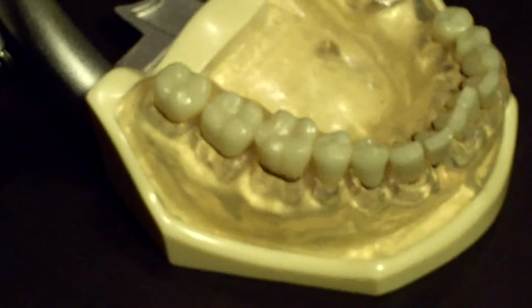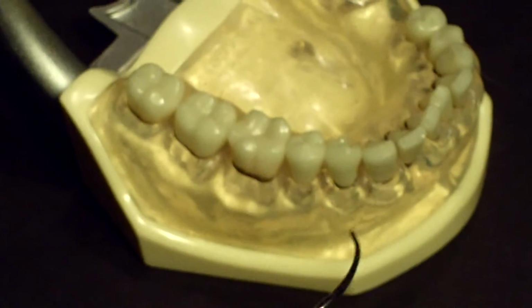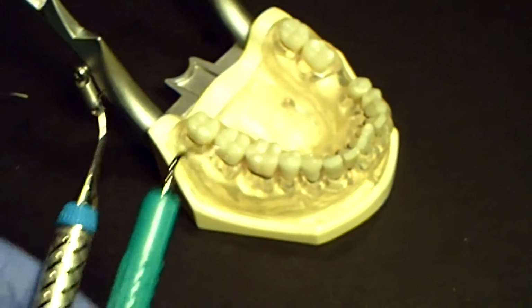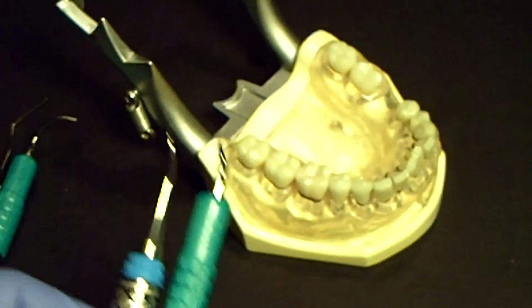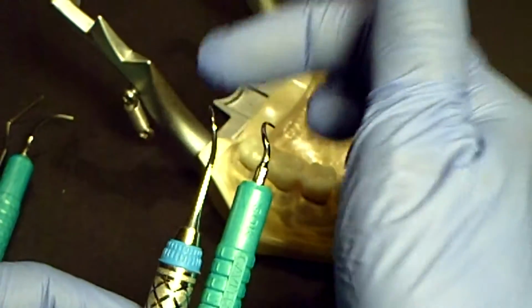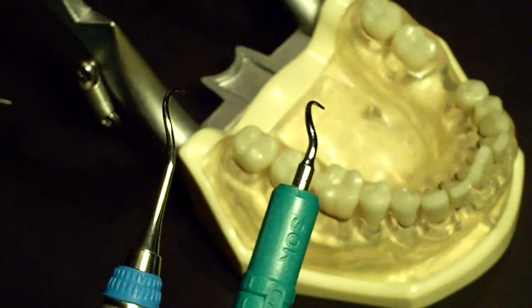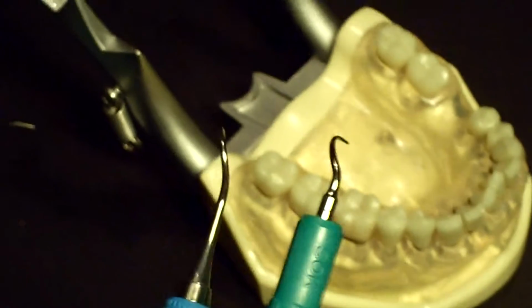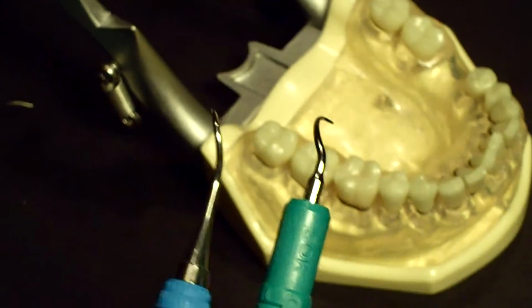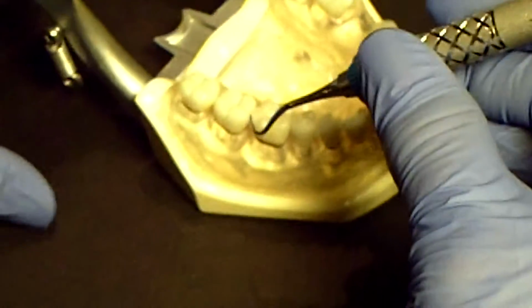We can also use the curved inserts in what we call the transverse approach, and that's in a more supra-gingival approach. And it's interesting, if you can see this, that it has the same curvature as the Nevi posterior sickle. So the Nevi here, this end curves to the left, and on your curved insert, curves to the left like so. So let's look at the transverse approach with the Nevi.